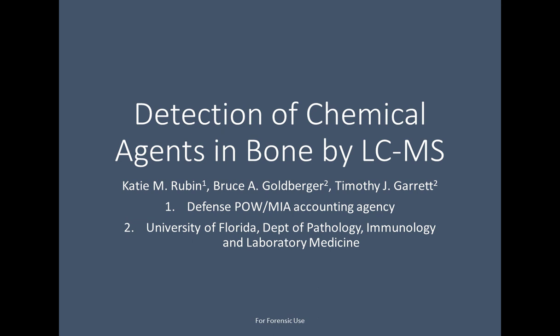By far, the most difficult part of the study was the extraction. There aren't many methods out there for extraction of these species from bone, and even the extraction of these species from blood can be difficult at times. And bone presents a very unique kind of matrix that mixes between both solid structure, meaning very difficult to homogenize and grind to get a medium that you can extract from.